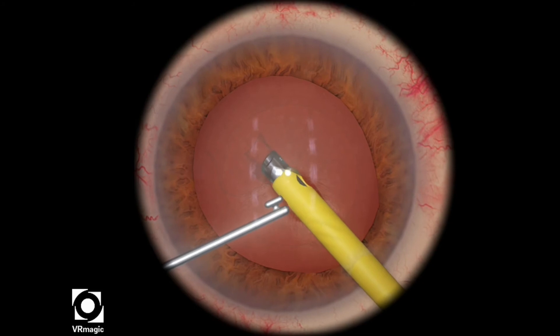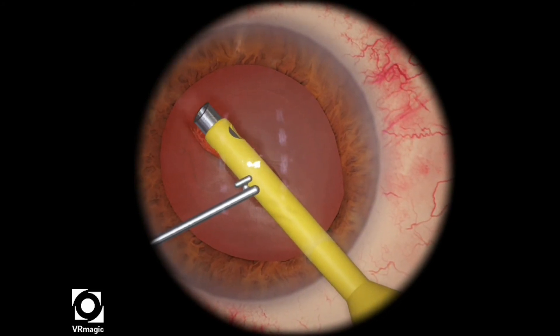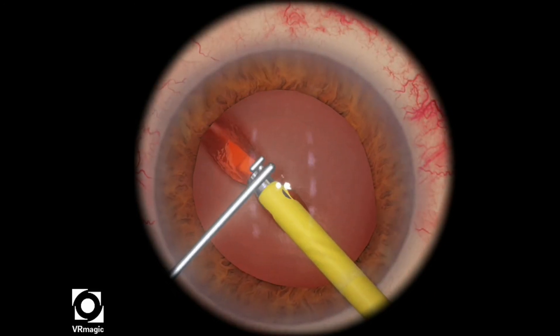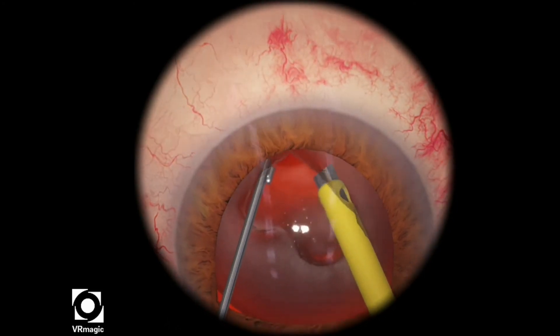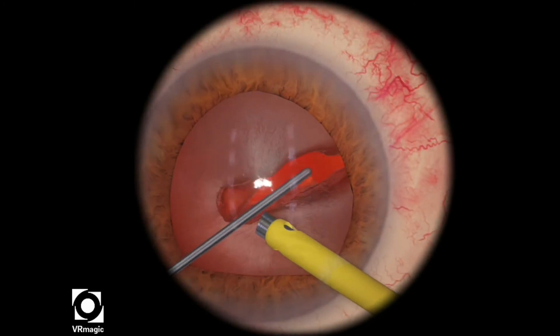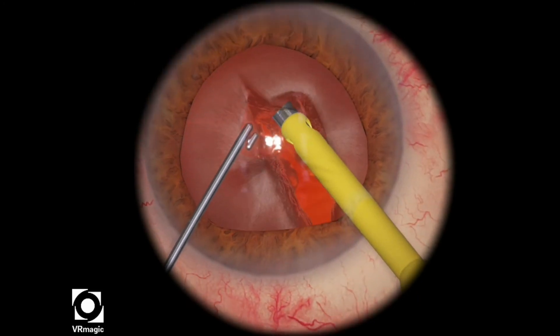I've experimented with this before, and if you create a trench in the regular fashion like you see in some of the YouTube videos, the machine thinks that you're leaking ultrasonic energy and will only give you like a 70 or a 60. So you want to actually use as minimal ultrasonic energy as possible to create a trench that's deep enough that you can propagate your crack.